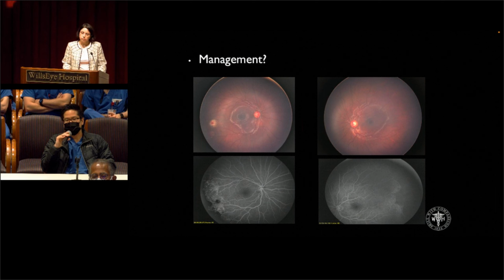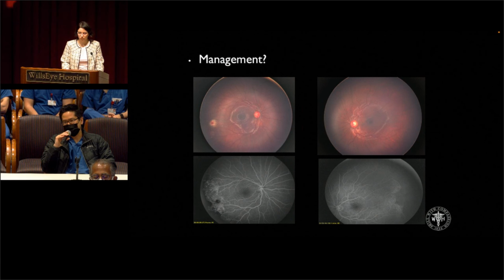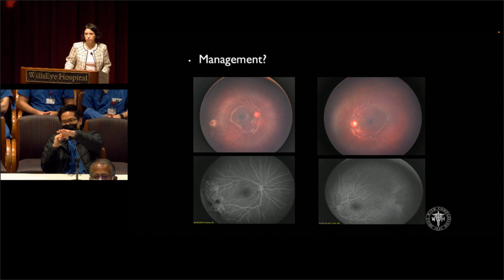And if you have avascular retina leakage, these conditions tend to progress. We don't know at what tempo, but here, this is a RetCam image under anesthesia, the kid's asleep, and the child's going to have a lot of medical issues and procedures coming up. You don't know when you're going to be able to do this again. I think it's reasonable to do a prophylactic peripheral laser to the avascular retina. And here, in this case, that temporal area, there's a little bit of traction already.